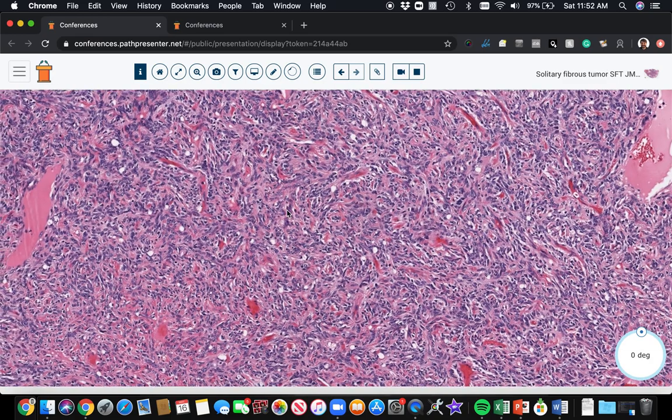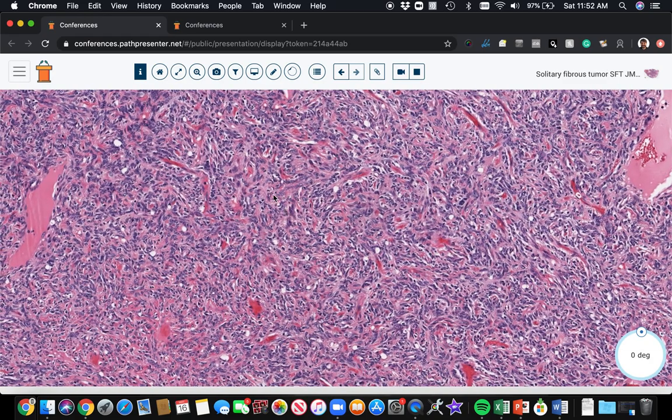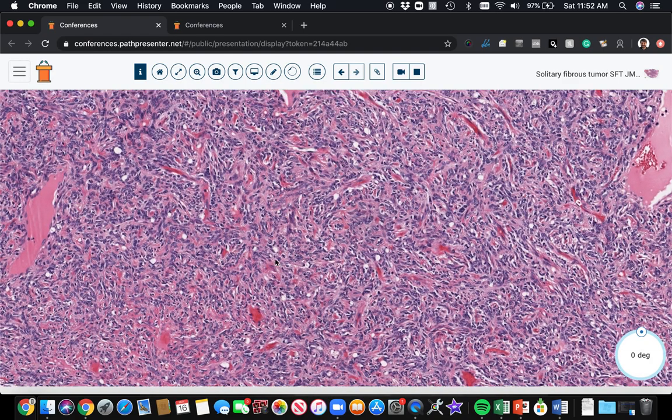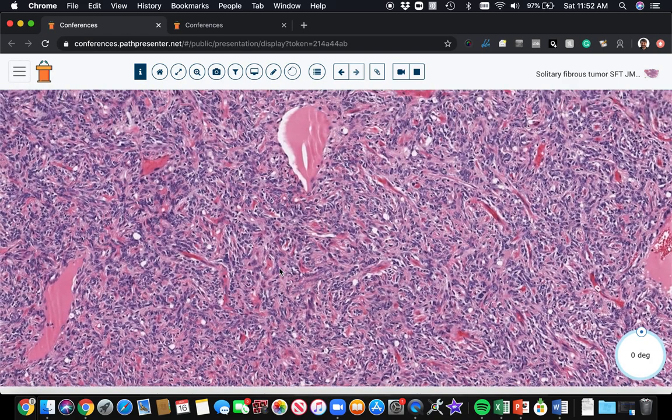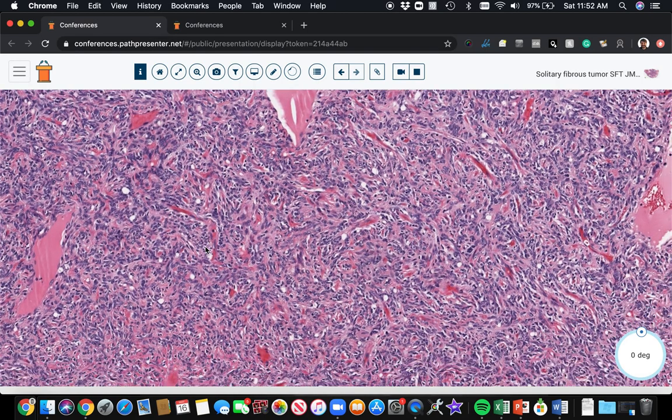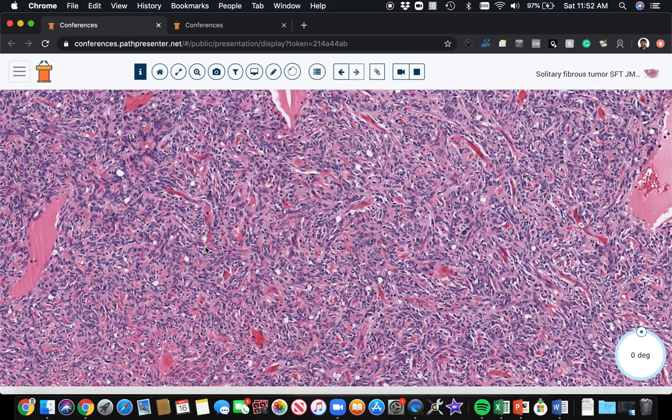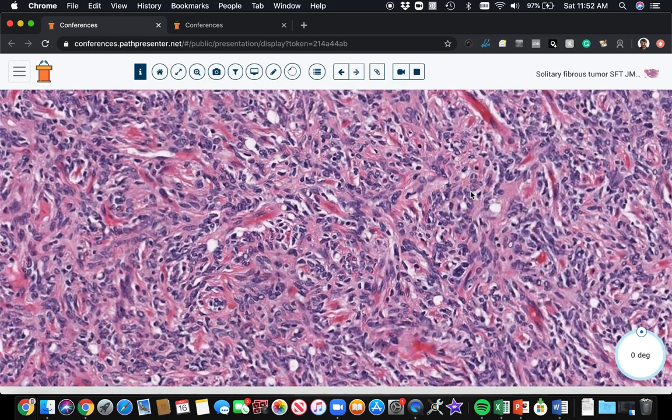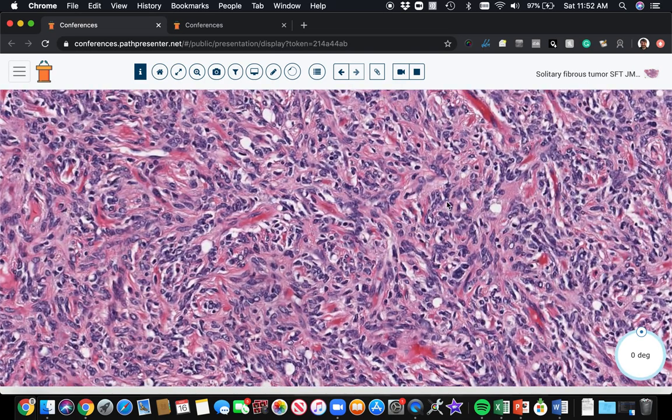And then the cells in general are supposed to be arranged like this in a patternless pattern. I believe it was Dr. Stout in the early 1900s who described the patternless pattern. And these cells are just kind of haphazardly arranged.